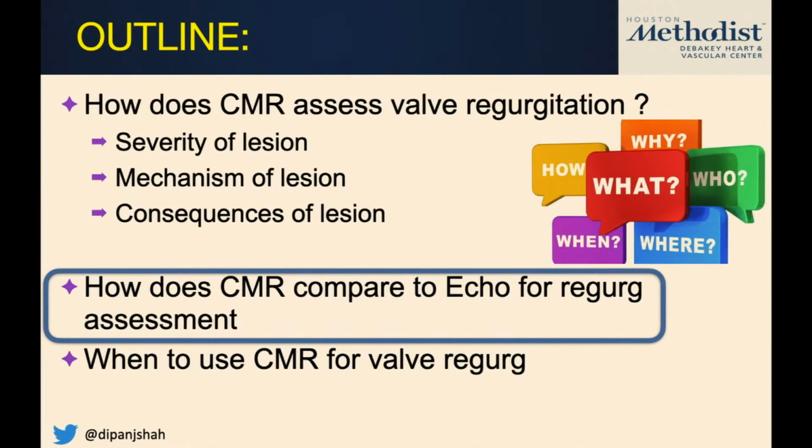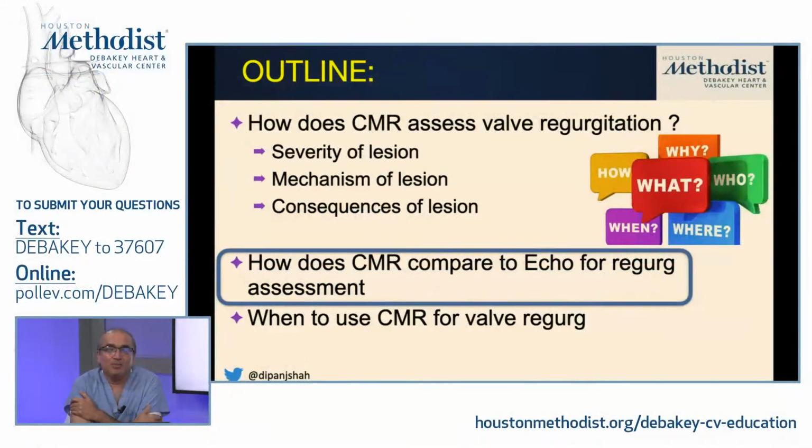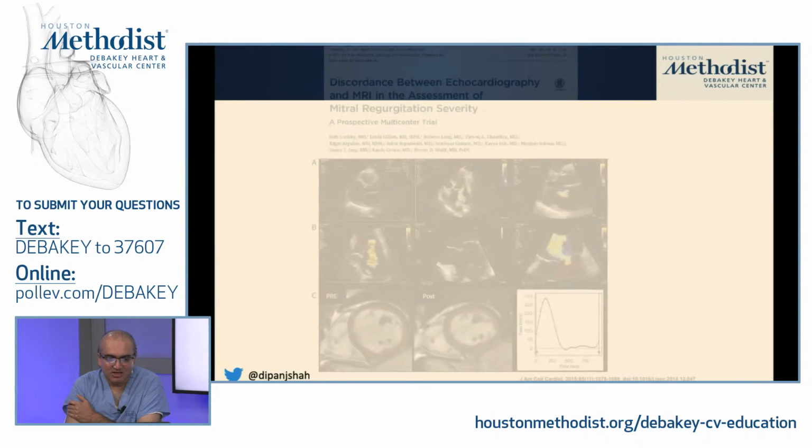Now, how does CMR compare with echocardiography? And I think I'll be the first to say that really the two modalities to a large extent are complementary to each other. And obviously, I think you're going to start off with an echocardiogram first.